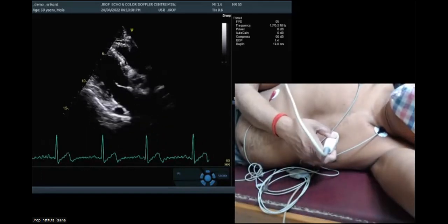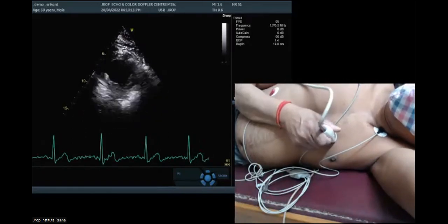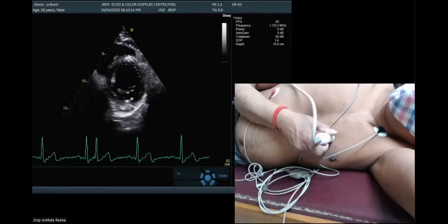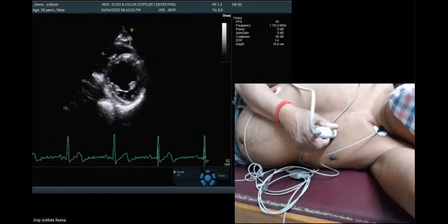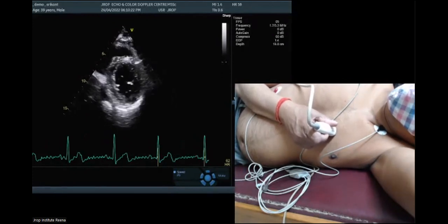Keep on looking where I'm keeping the cursors. So rotate 90 degrees. Aorta to begin with, as I said, then come back, mitral valve, and then papillary muscles. Now I'm freezing my image. So these are two papillary muscles, one over here, one over here. Now look at his motion.